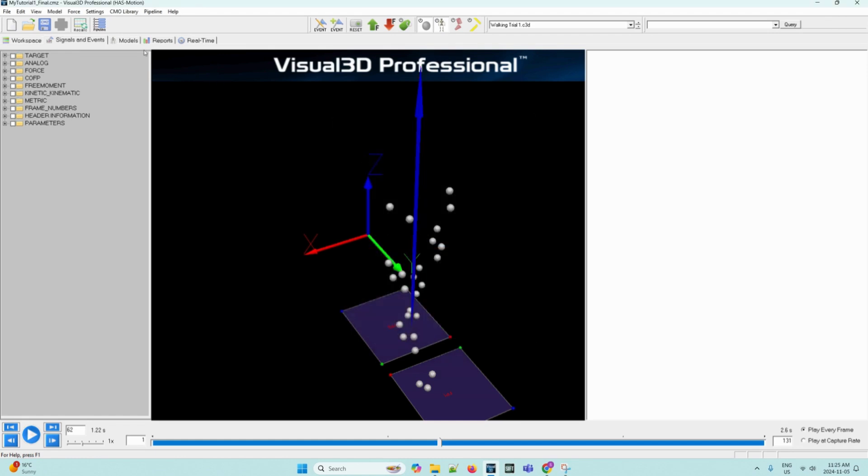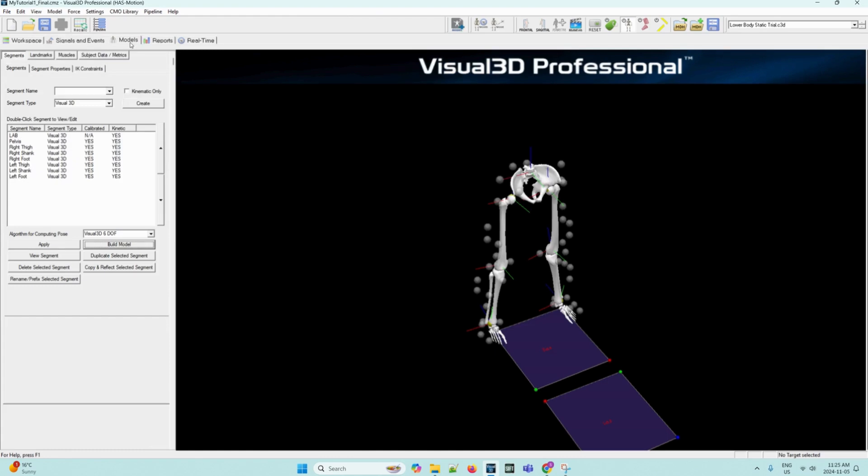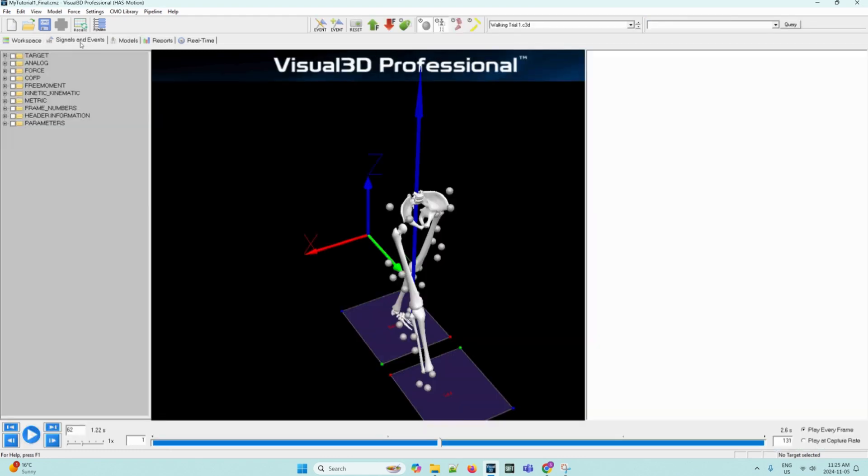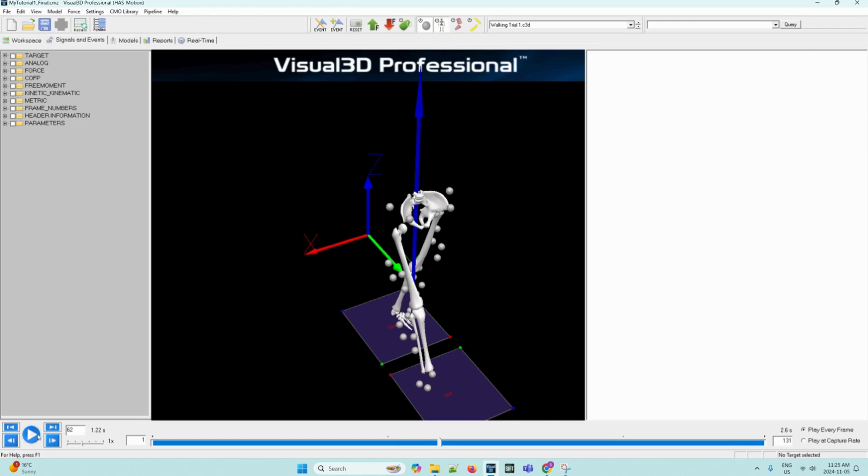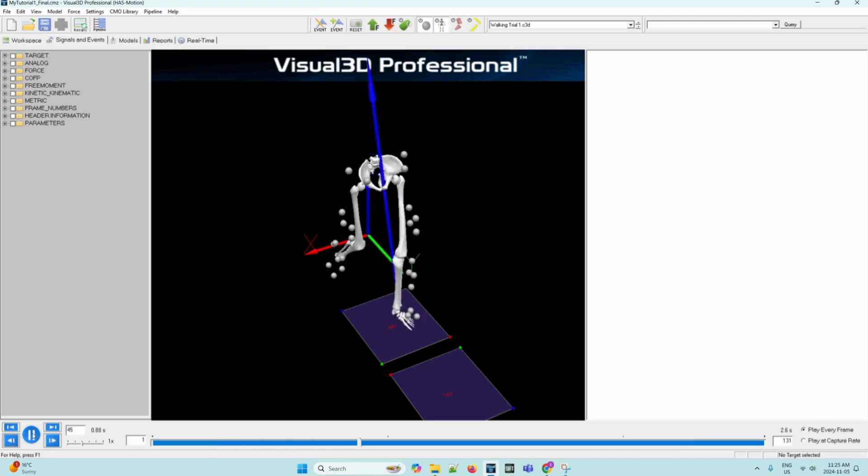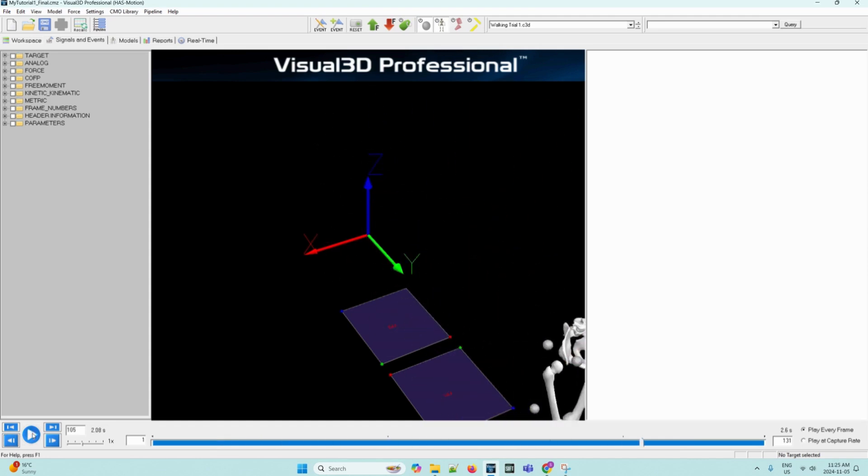Now we can click on the models page and then go back to the signals and events processing and make sure the view segment toggle is pressed on. The 3D animation viewer should now display a skeleton of the lower body that has been associated with your movement data. You can animate the skeleton by clicking the play button in the VCR controls at the bottom of the page.